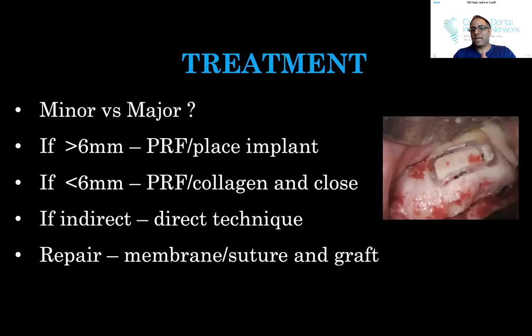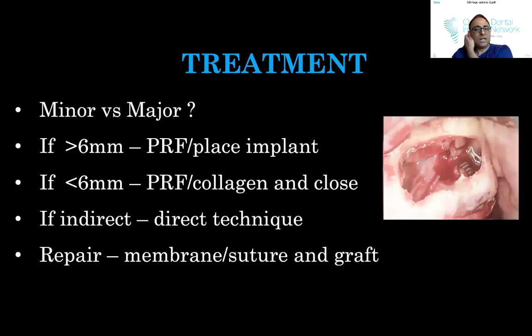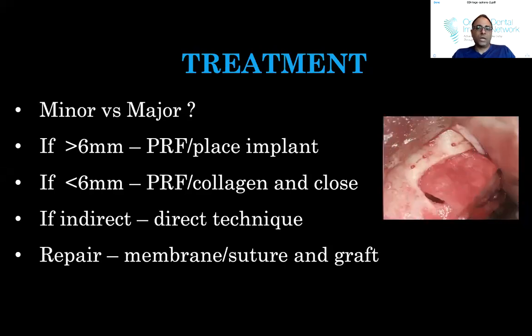Okay. So this is again, a lateral site. You can see there's a small perforation. It turned into a large perforation, at which point in time we've got immediate implants in there. There's a huge perforation in the site. So this is more of an advanced technique. We're actually going to drill a couple holes, so 2 holes on each side.